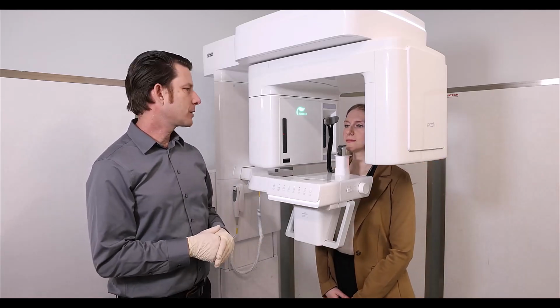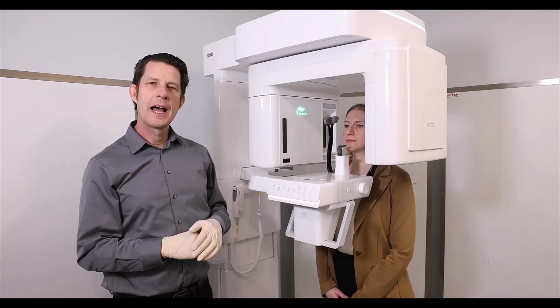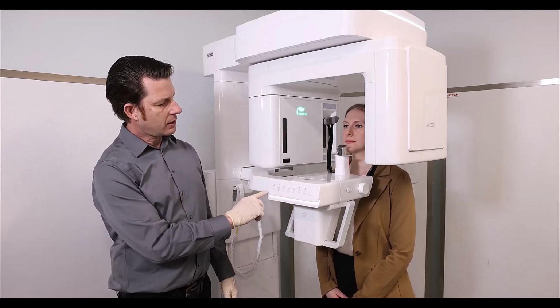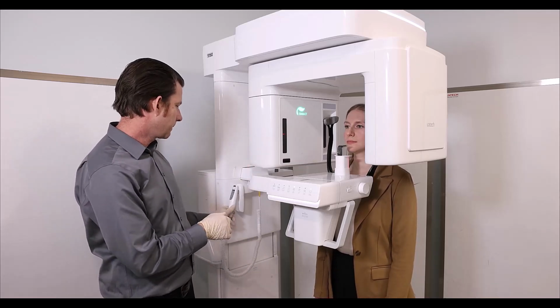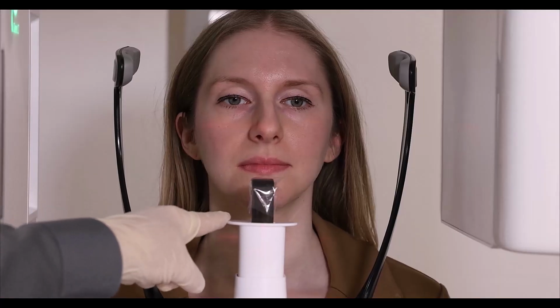What I'm looking for is to make sure that their chin rest is just below the chin. So ideally I want to have them looking out at the horizon in a natural head position. I'm going to go on the chin rest here, column up or down, or I can use the hand switch here to raise or lower this chin rest. So I'm going to have the chin rest just below the patient's chin.